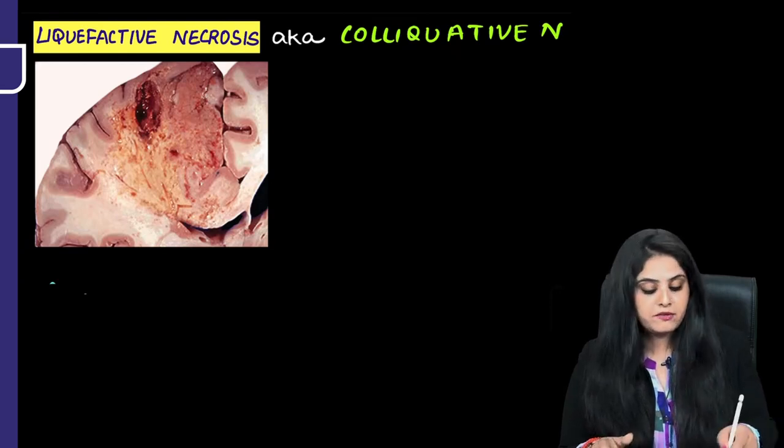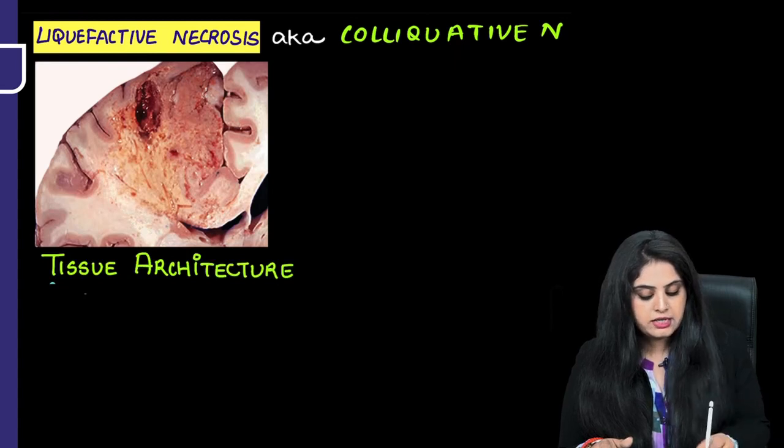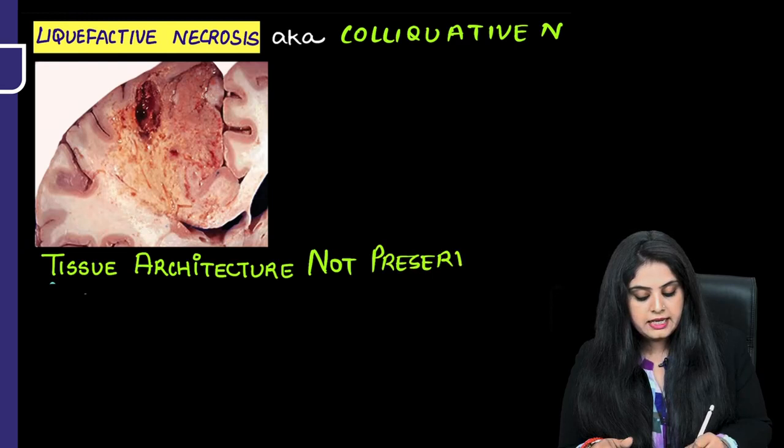Something is going to become liquefied, and I can see that over here. So what is the first point? That the tissue architecture has not been preserved. Solid has changed to liquid.